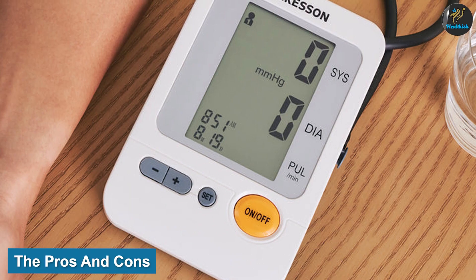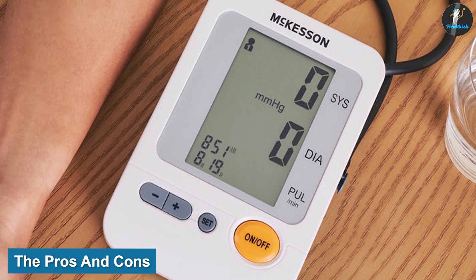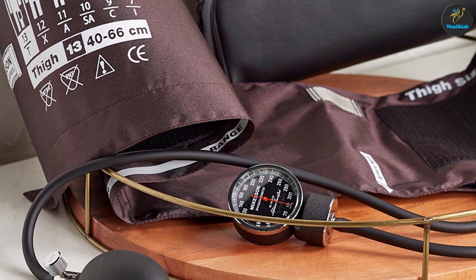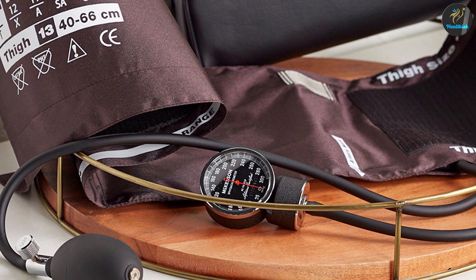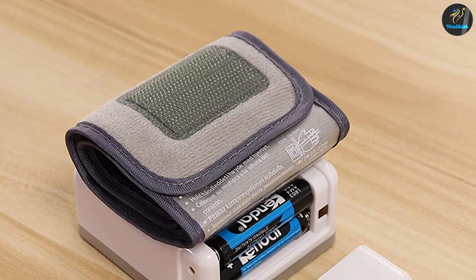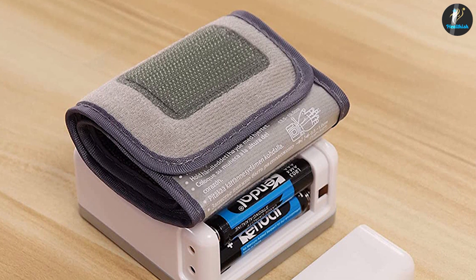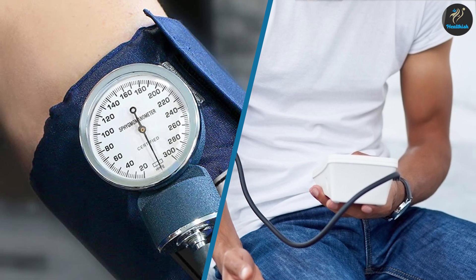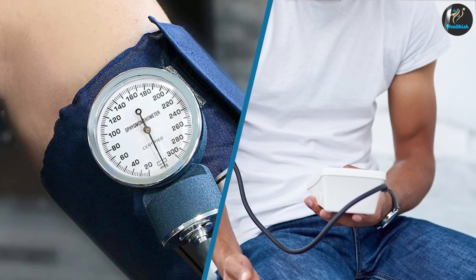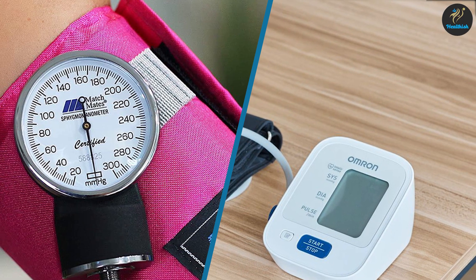The pros and cons of automatic vs. manual blood pressure readings: taking blood pressure readings can be a good or bad decision depending on your preferences, although automated readings are generally more accurate than office readings. They may not always be as precise in some cases. The cuff is less precise than a variety of other methods, but it is usually more comfortable for many patients. It is critical to consider the advantages and disadvantages of each option before making a decision.